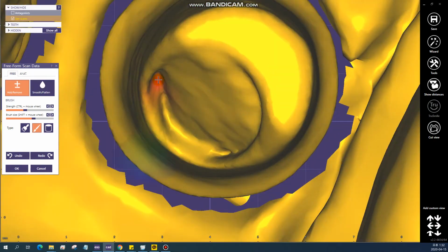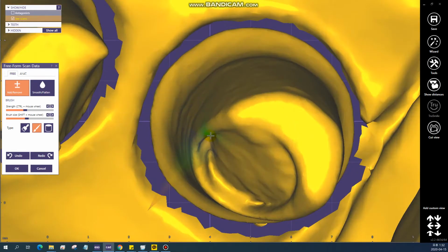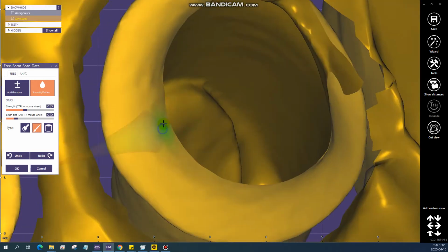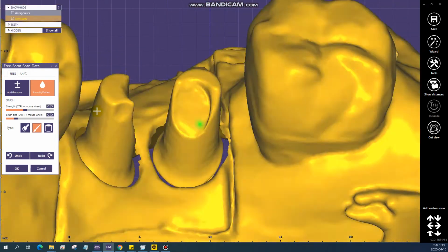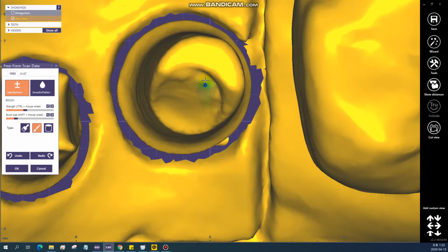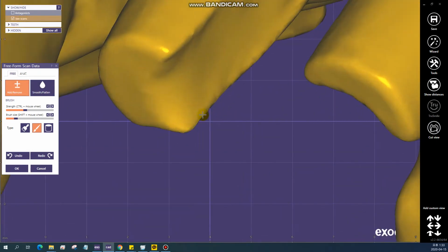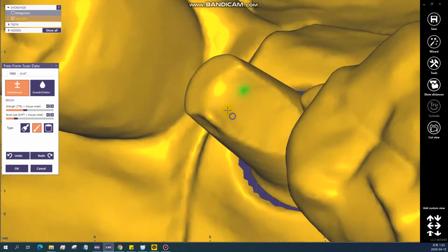And here's the thing: when I try to edit, you can see a little uneven part. So here's the little tip. I flip it and add a little sharp edges, and you can see the softener when I flip it again. Okay, almost done. Then here's a little small part that's hard to mill, so yeah, I have to add it more.